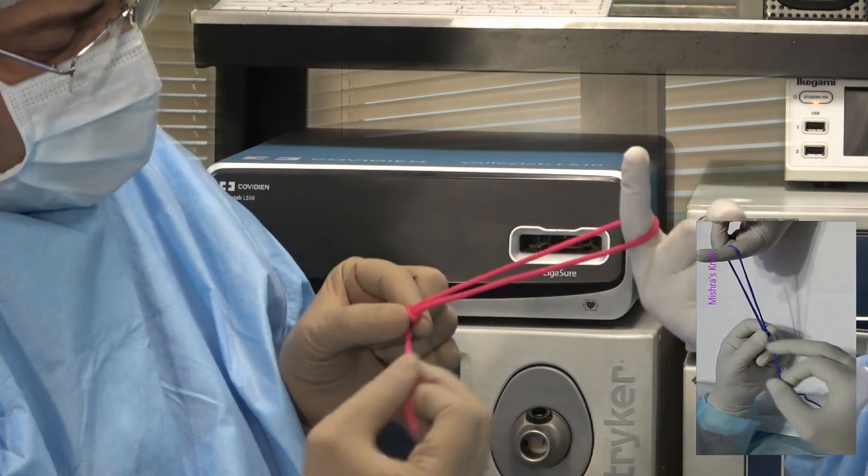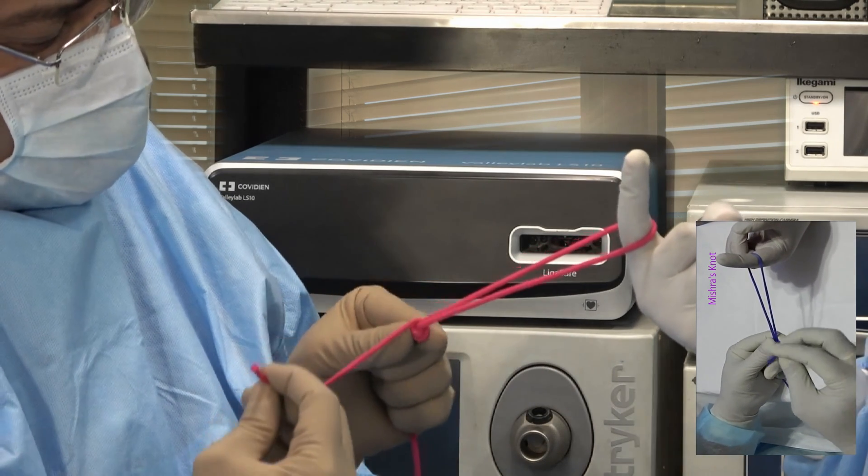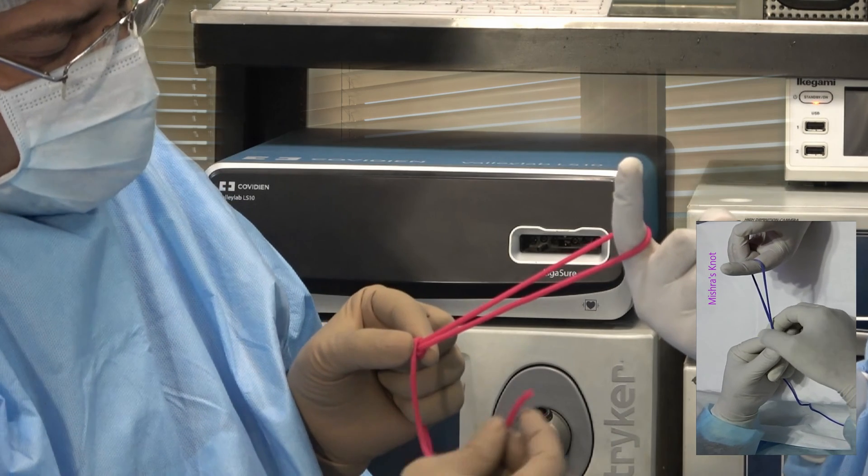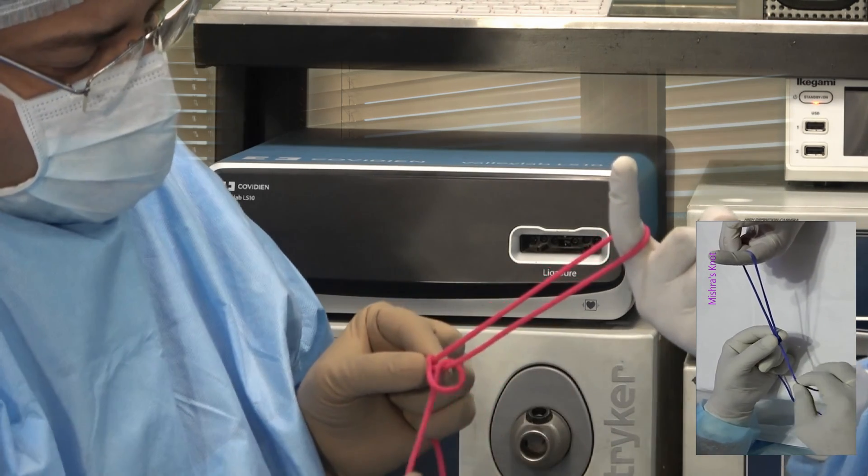After locking, you will take a second wind. This is the second wind and again this also will be locked. One half knot will be taken and this is locked.